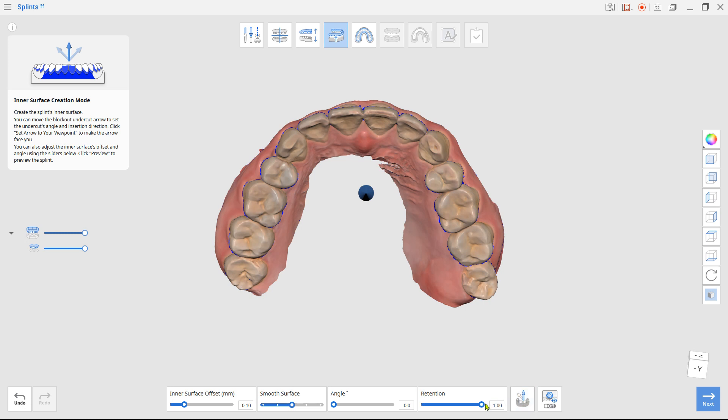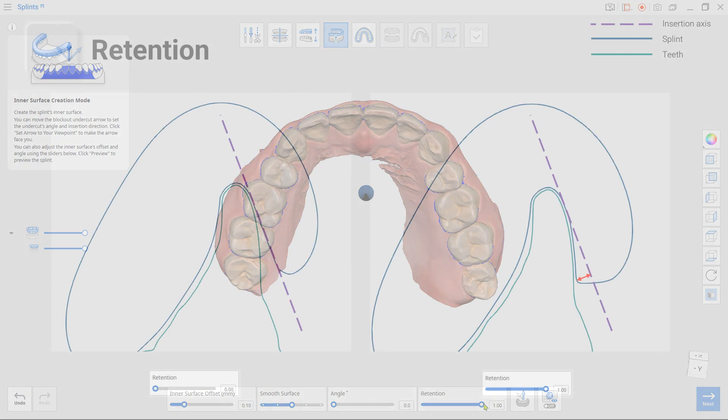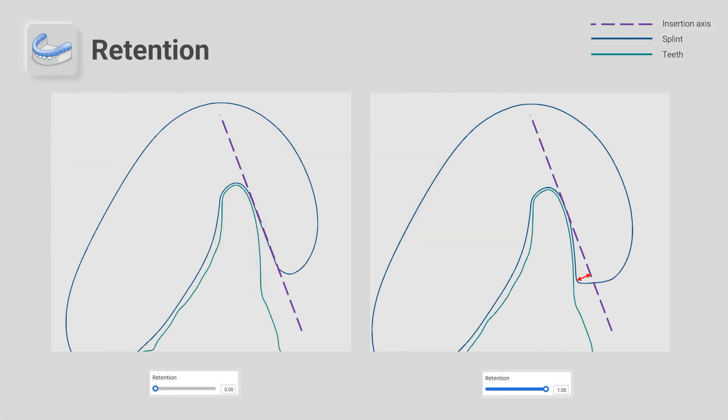And regarding the retention, this is how the retention works in the system. Without retention, the inner surface will be created on the blocked out plain surface just like the one on the left. With maximum retention, the block out won't apply to the inner surface creation like the one on the right.